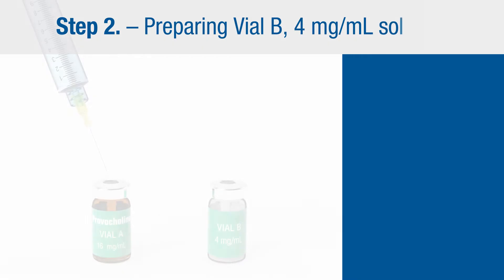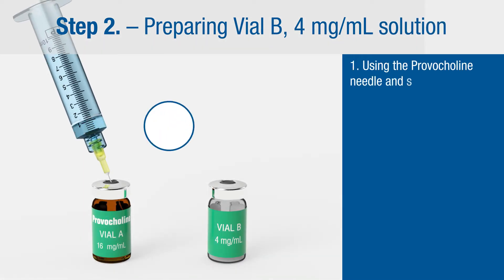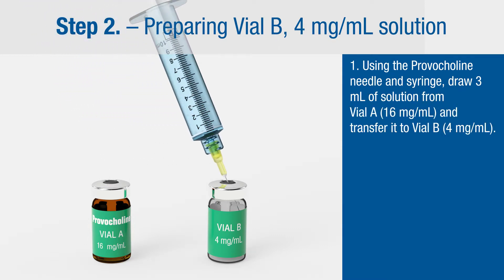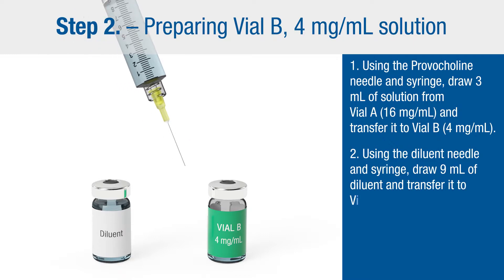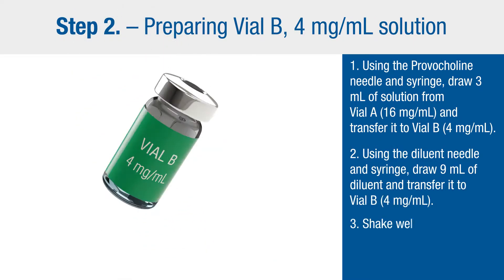Step two: preparing vial B, 4 milligram per milliliter solution. Using the Provocholine needle and syringe, draw 3 milliliters of solution from vial A and transfer it to vial B. Then using the diluent needle and syringe, draw 9 milliliters of diluent and transfer it to vial B. Shake well.